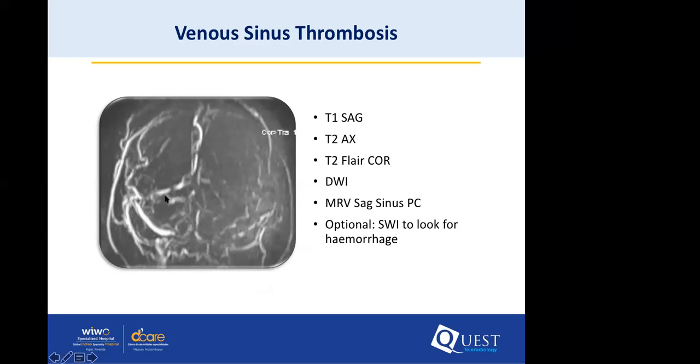So the next one, sinus thrombosis, again getting much more common, in younger patients, women who are on pills. We seem to see a lot of these things in them. So it's more and more routine. If you have a question of that in the clinical form, try and get an MRV image. A non-contrast is more than enough. Here we have thrombus of the left transverse and the sigmoid vein with multiple collaterals here.